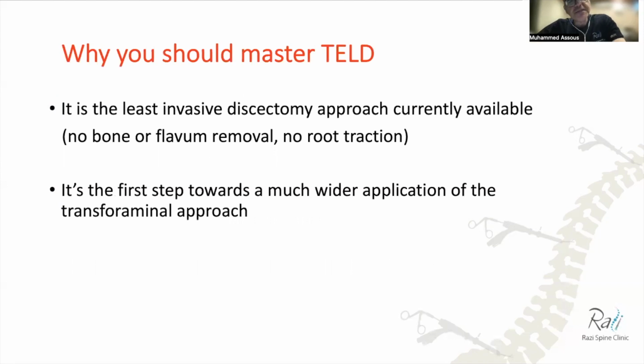Why do you need to master the transforaminal endoscopic lumbar discectomy? Because it is, without doubt, the least invasive discectomy approach available to us today. And it is the first step for you to master the transforaminal approach, which will open the door to the canal, as well as allow you to treat all the pathologies inside the foramen.